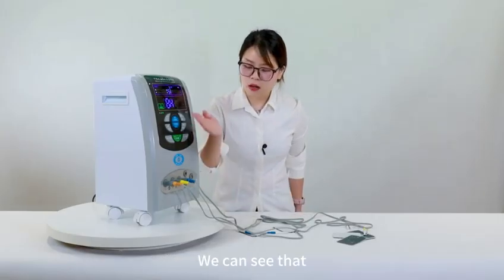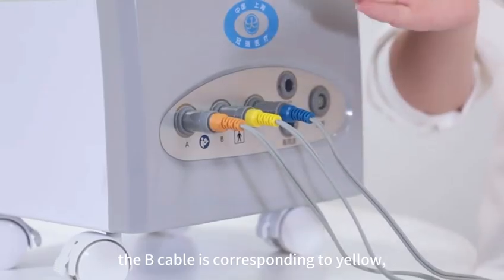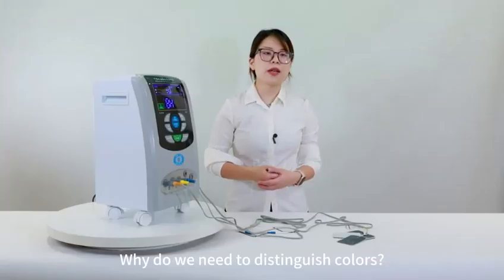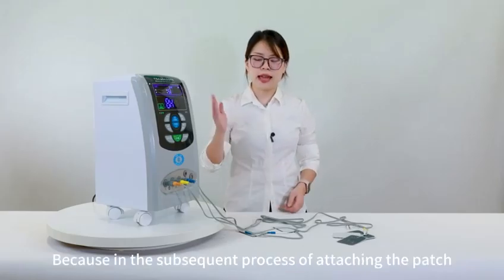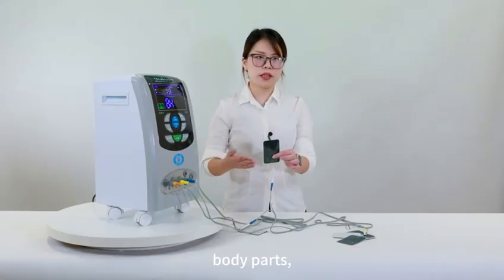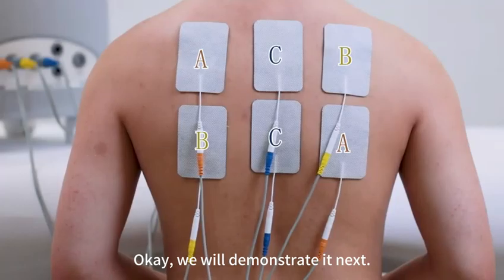We can see that the A connection cable corresponds to orange, the B cable is corresponding to yellow, and the C cable is corresponding to blue. Why do we need to distinguish colors? Because in the subsequent process of attaching the patch to the body parts, we need to cross them. Okay, we will demonstrate it next.